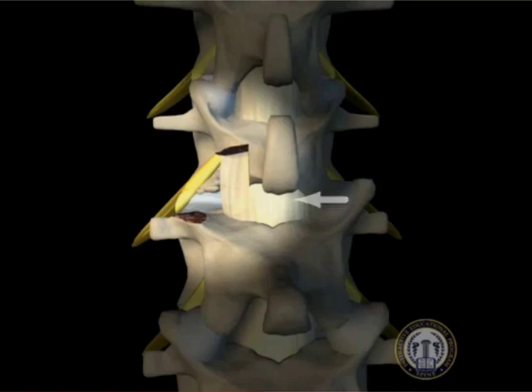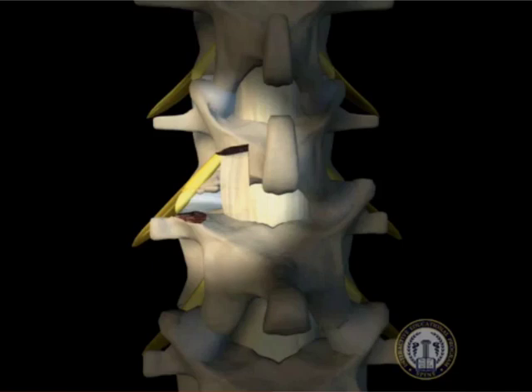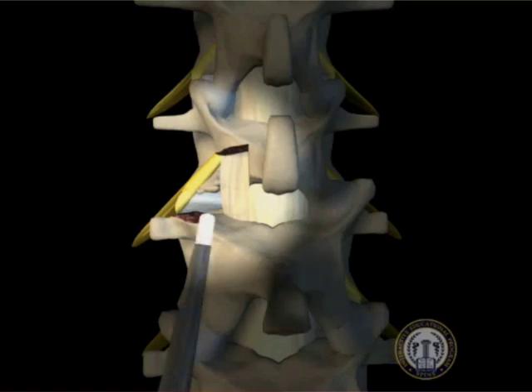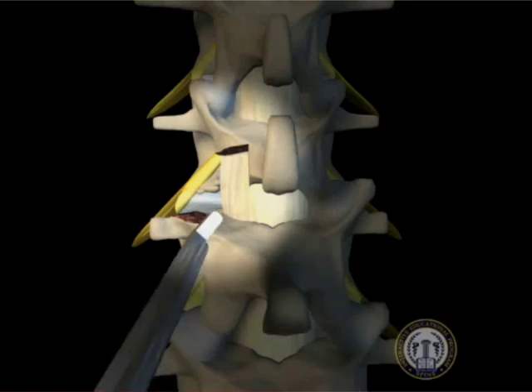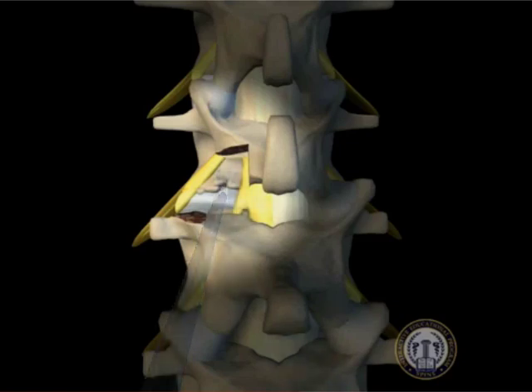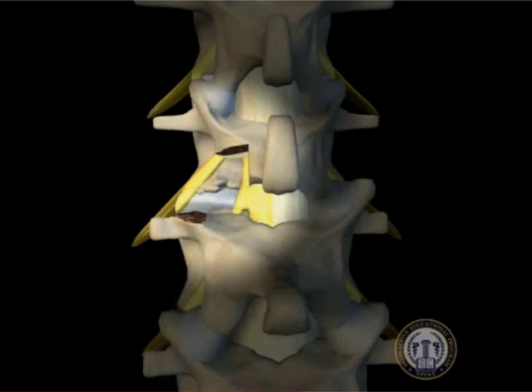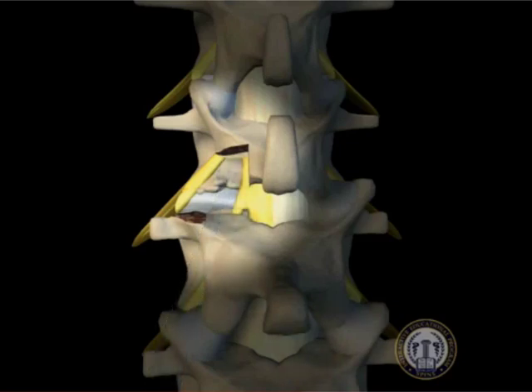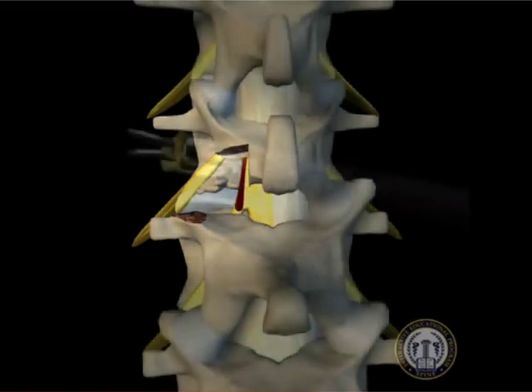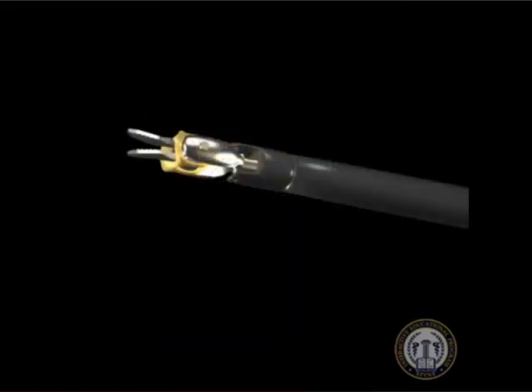A ligamentum flavum covering had been left intact to protect the dura mater and nerve roots during the facetectomy. This covering is now removed in a stepwise fashion using Kerrison rongeurs to expose the traversing and exiting nerve roots. Epidural bleeding frequently occurs during this step of the procedure and may be controlled using bipolar cautery and thrombin-soaked gel foam.